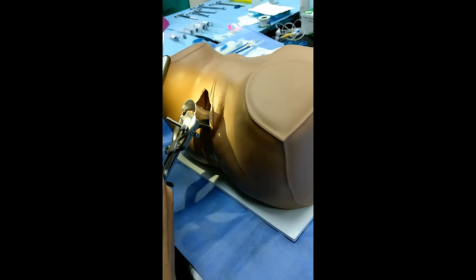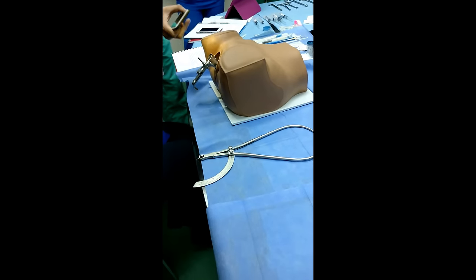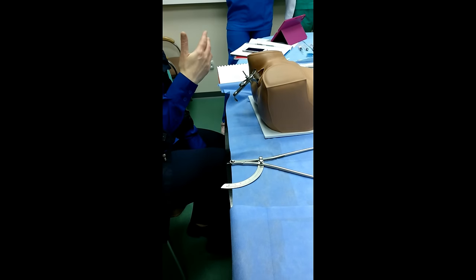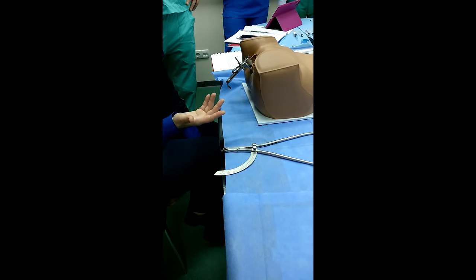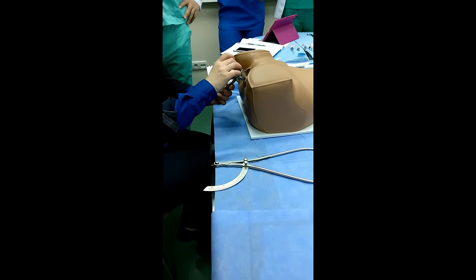You see the cervix, so you must explain to the patient. The appearance of the mucosa is normal. The shape of the cervix, conic or cylindric. The appearance of the external os. There are pathologies, ectopy, or there are no pathologies. The character of the mucus.